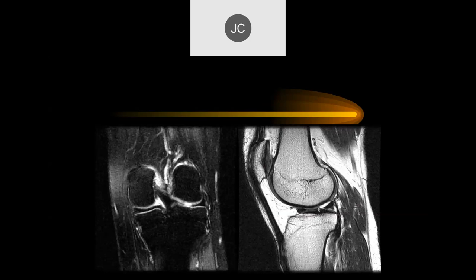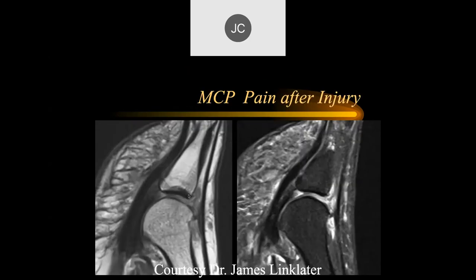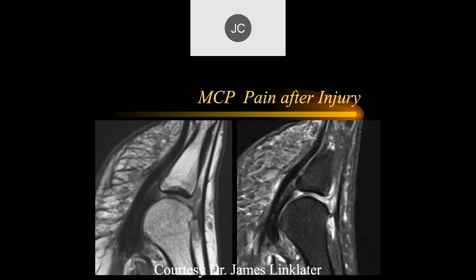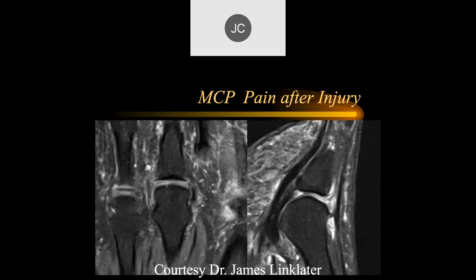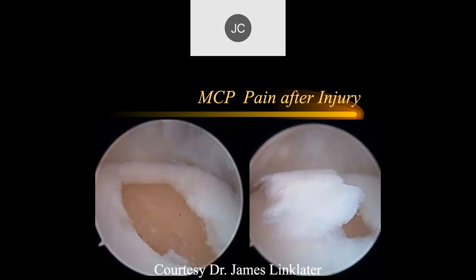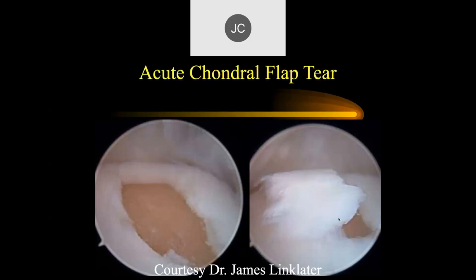Here's another example of a full thickness, relatively acute defect. In this case, there's really no underlying bone edema. The patient had MCP pain after injury. It looks like there may be a full thickness fissure — really hard to see. But this patient went to arthroscopy, and there was an unstable defect. When they peeled it up, there was a big defect — and when debrided, it was a fairly large lesion. This was significantly under-visualized on the MR examination — an acute flap tear.